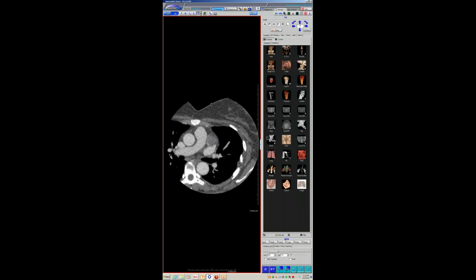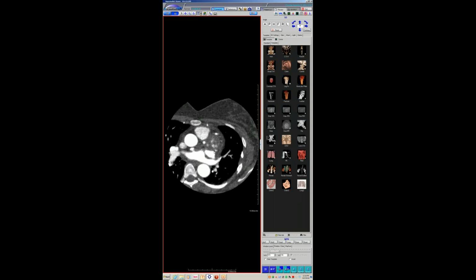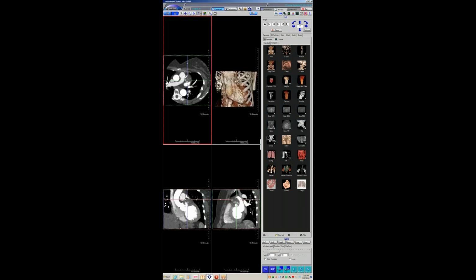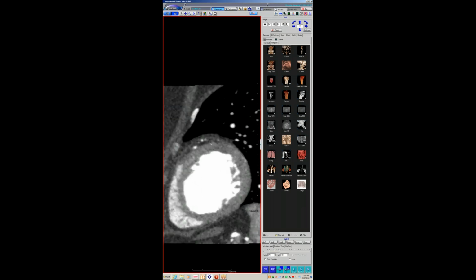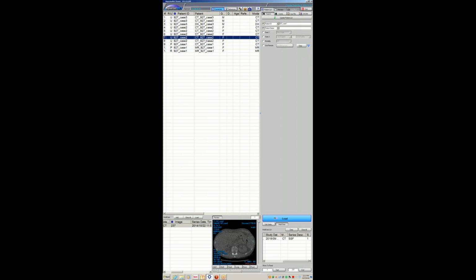And the interesting thing, presumably, we're not 100% sure, but that little infarct was likely due to, let me see if I can go back to the original. If you could see here, there's a ramus that is basically knocked out at its origin by the pressure effect. So we're not entirely sure if there was an embolic process into the LAD itself that led to some sort of little embolic infarct, or if this is chronic occlusion of the ramus leading to that little focus of infarct, which you can see right here, which is kind of where the ramus is heading towards. So anyways, interesting case.